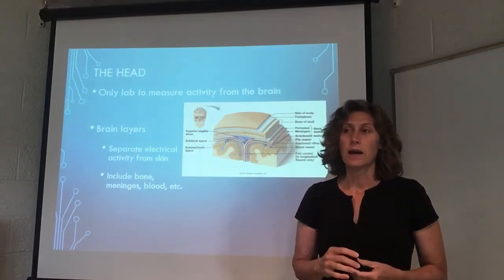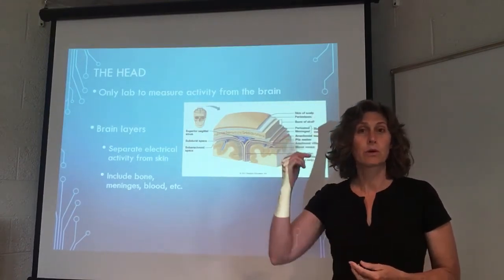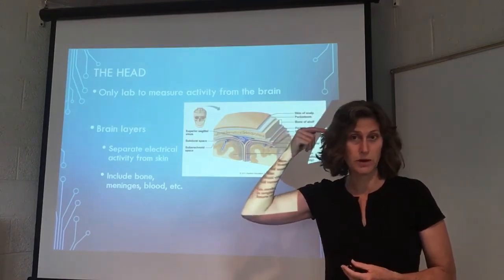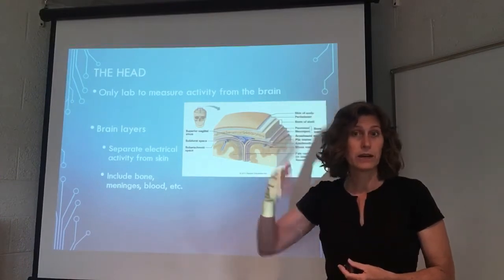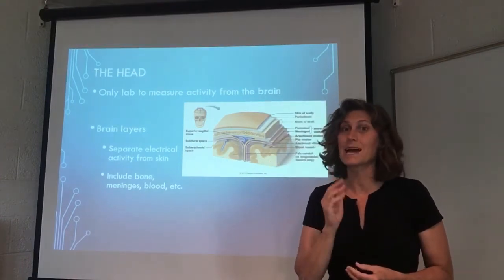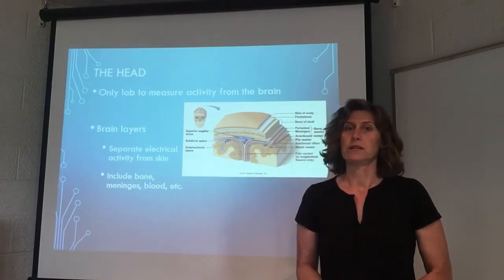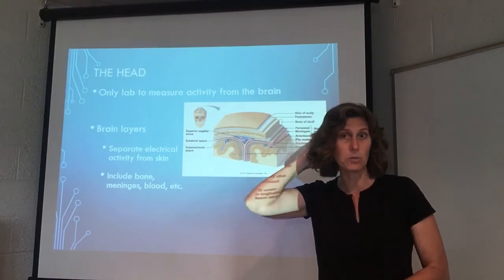So as you might have studied in other classes, you can do single unit recording where you actually stick a probe inside a person or an animal's brain, touch one little tiny cell in there and record something, and you know exactly when that cell is firing or not. This is non-invasive, so we have to work at the surface of the scalp.